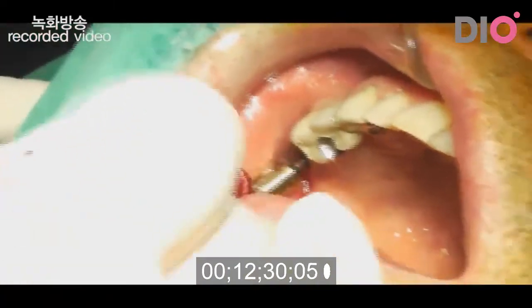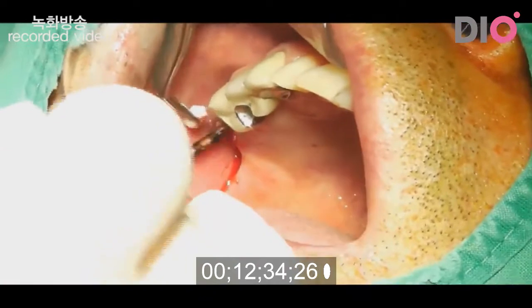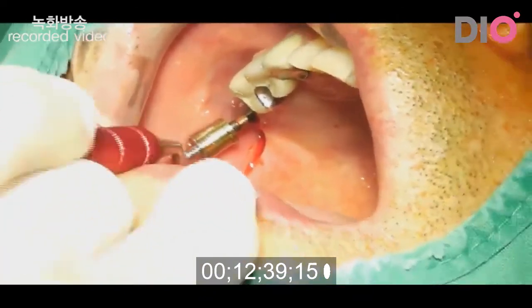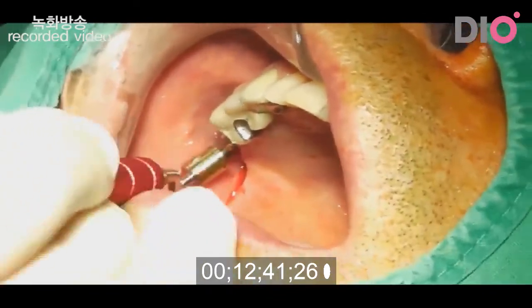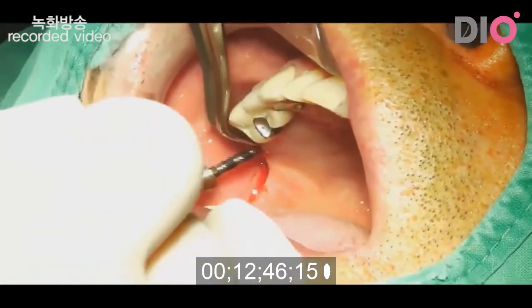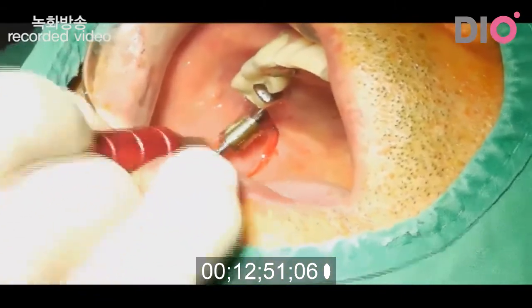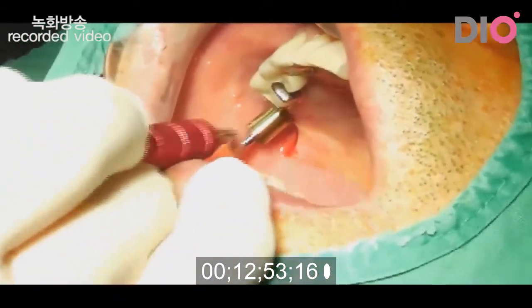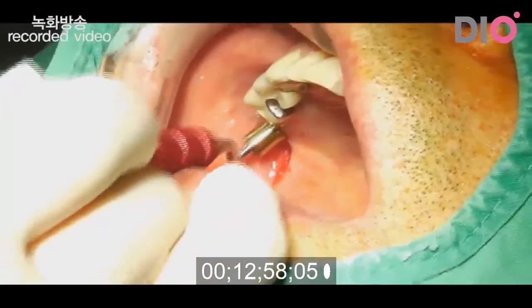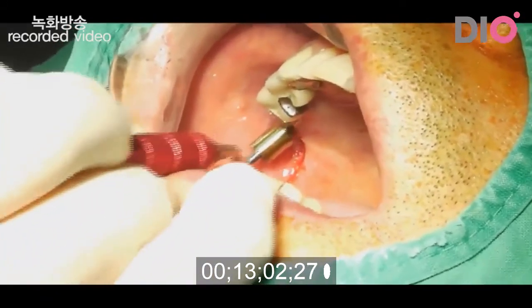Okay, next one. You must use the stopper to protect the sinus membrane. Okay. I insert the collagen sponge.